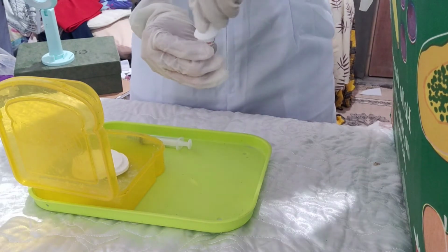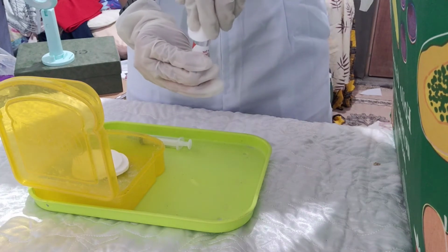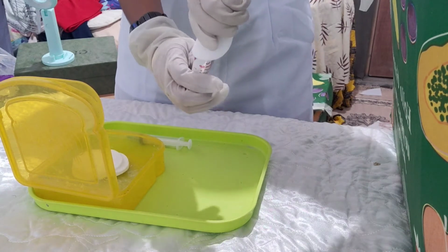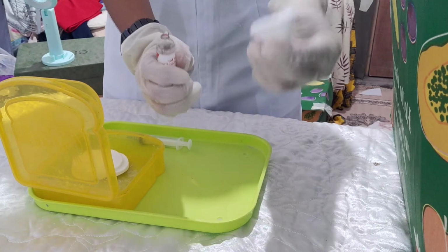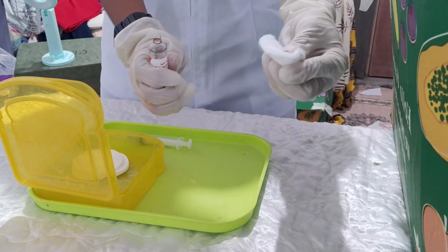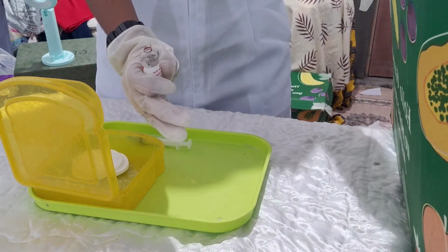We will carefully break the ampule and make sure to keep ourselves safe from accidental cuts and injuries. Now we will cut this by holding it like this, and now we will discard the head part of the ampule. Discard it in the proper way.